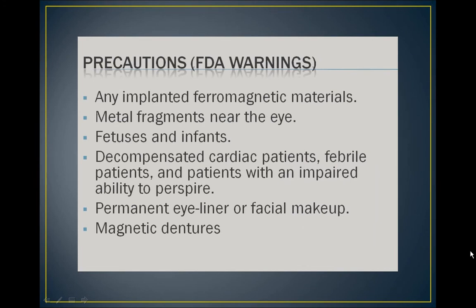As an MRI technologist, we need to ensure a patient does not introduce any ferromagnetic objects into the MRI suite that could become a projectile. This includes hearing aids, dentures, partials, plates, keys, pagers, cell phones, eyeglasses, hairpins, barrettes, bobby pins, jewelry, body piercings, watches, safety pins, paper clips, credit cards, coins, pens, pocket knives, nail clippers, tools, clothing with metal fasteners, and clothing with metallic threads.